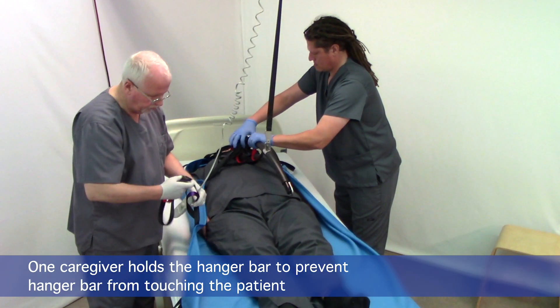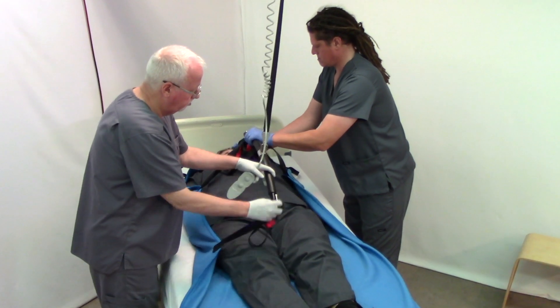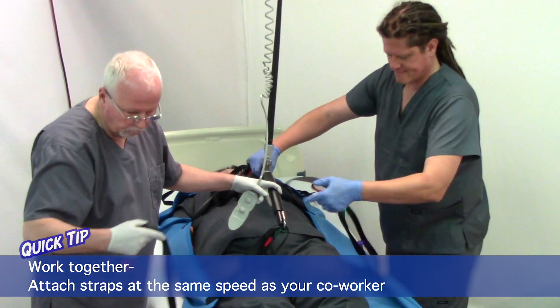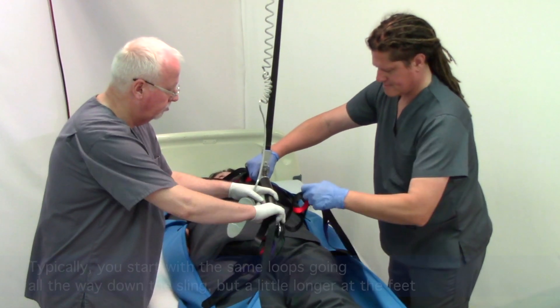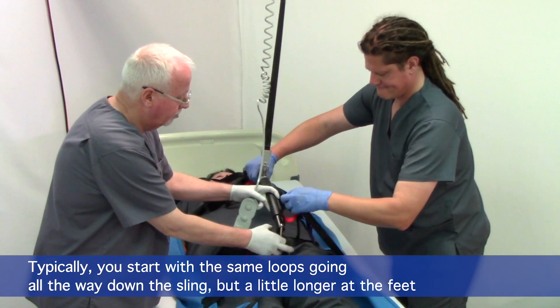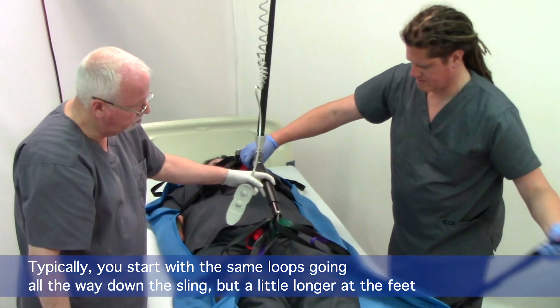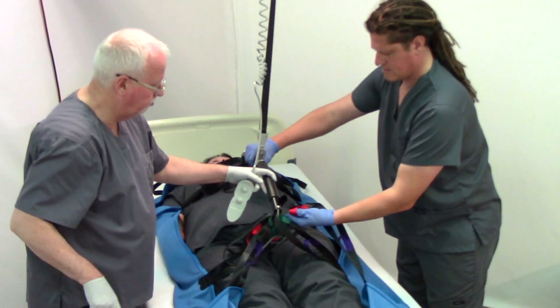One person's got their hand on the hanger bar for control, and the hanger bar is a two-point hanger bar, so it's running the length of the patient's body, making it a little easier to hook the sling on and off. We're going to go longer towards the feet so that the sling stays under the patient's legs when we lift her.